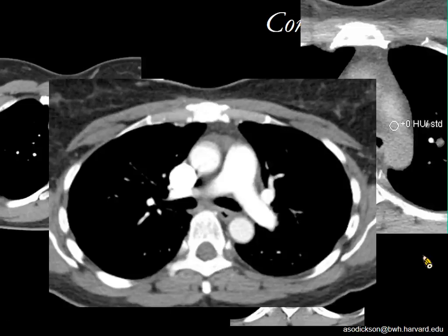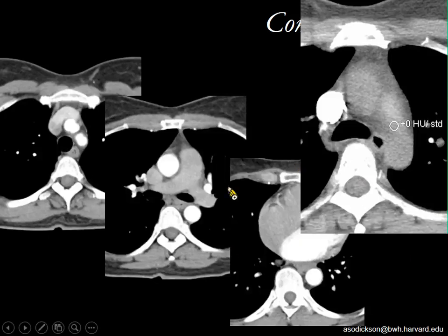The other trick that I actually like very much is if the technologist is having a hard time from their scan identifying exactly where the pulmonary artery is, or perhaps the patient is breathing very rapidly and they're concerned about missing it, they should just center on this portion of the mediastinum, put the region of interest here, where we know it won't change at all, and simply watch. And they'll see contrast come in the SVC, they'll see next contrast flow to the pulmonary arteries, and only if they wait much longer will they see contrast come around to the aorta. But as soon as they see the first hint of contrast in the pulmonary arteries, if they trigger the scan, you'll get a beautiful result almost all of the time.